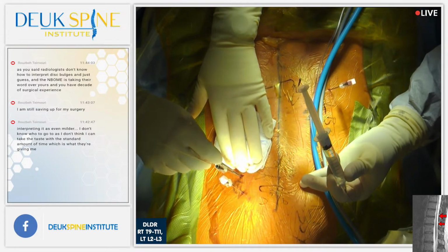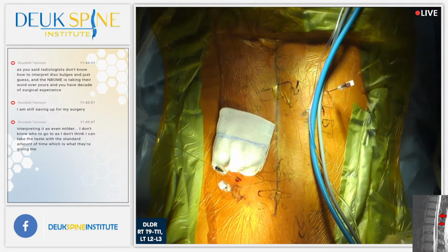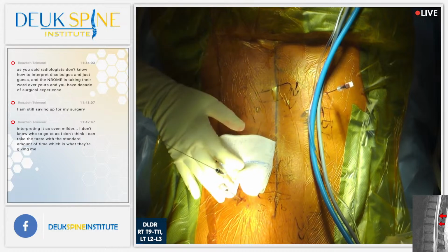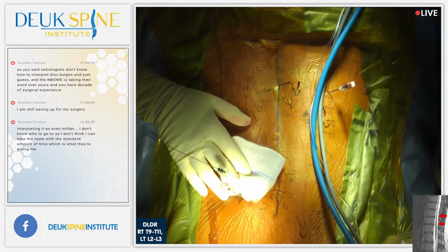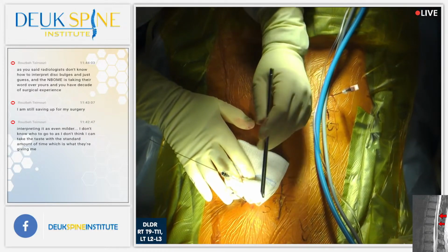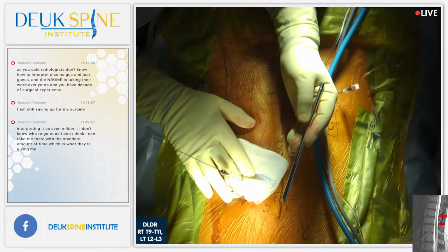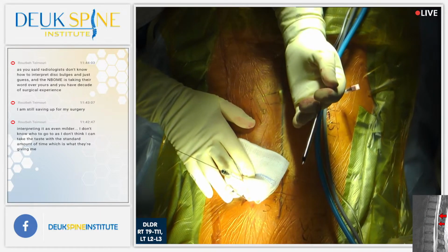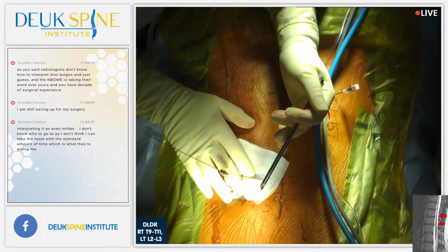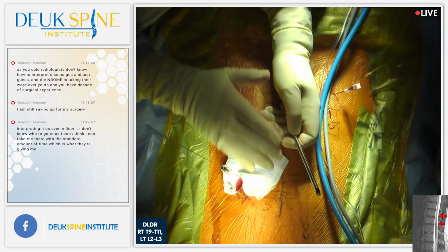What do you got there? The reason why we do 7mm, let's show them the tube. Can you count out loud from 1 to 100? Okay. So we have two types of endoscopes. One is large, one is small. We use the large one for large discs. We use the small one for small discs. He's Texan. Texans, everything's big. Remember? Everything's bigger in Texas. So he's got big discs. We're going to use the bigger tube. But that said, the diameter of this tube is 7mm.